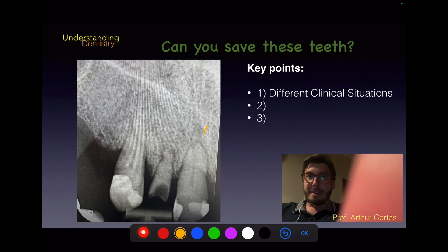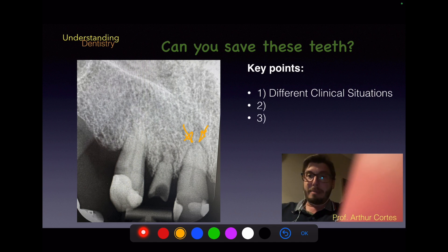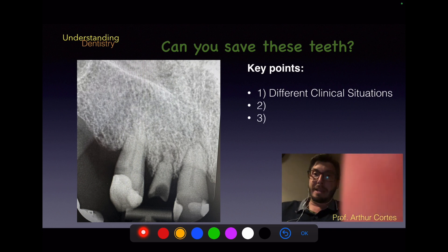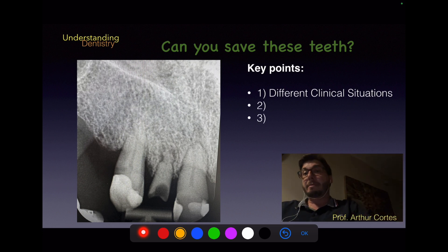We'll comment on the periapical region shortly. I hope you notice that there is periodontal ligament space widening, probably related to these restorations. The pulp chamber is also atrophic. We need to understand the treatment plan implications of these findings.